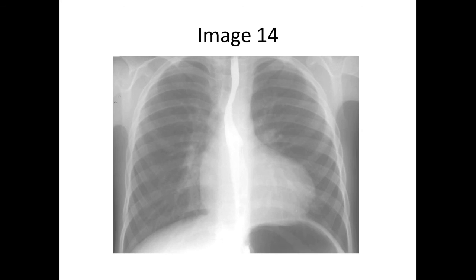As a result of that right ventricular hypertrophy that you will see, you have a characteristic heart shadow that occurs here. Notice how the left side of the heart almost appears as though it's projected this way. But what I really want you to concentrate on here is this prominent right side of the heart shadow. And a radiologist somewhere said that this kind of looks like a boot. So the characteristic radiographic feature that we see here is a boot-shaped heart. And so that is characteristic for tetralogy of Fallot.